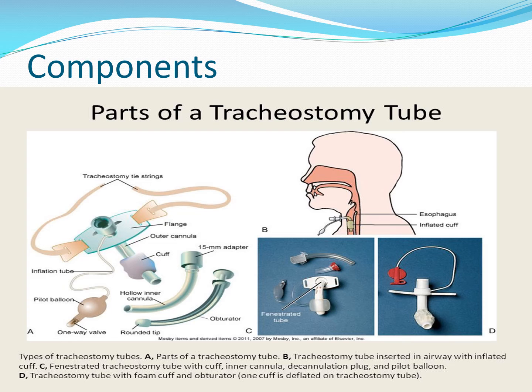And then on the lower right-hand portion of this picture, instead of a line image, it's showing you the actual tubes themselves, showing you, for example, one that's fenestrated and where that fenestration is actually located.